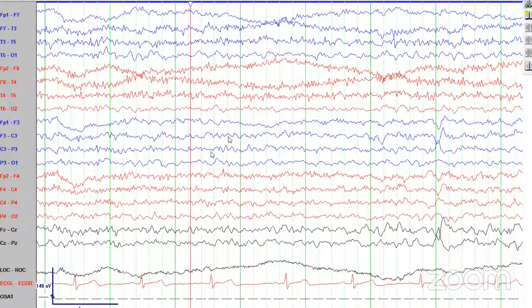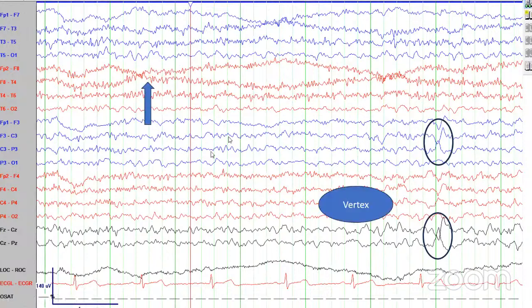Now this is still NREM because we can see the slowly roving eye movements over the anterior temporal electrodes. We can see this mixed frequency. The additional finding is these sharply contoured, not very spiky activity appearing over central electrodes. These are apparent over CZ, C3, and there is also something over C4. So over the central head region, these start coming. This is basically the appearance of vertex waves. And of course, we've already seen the slow roving eye movement.